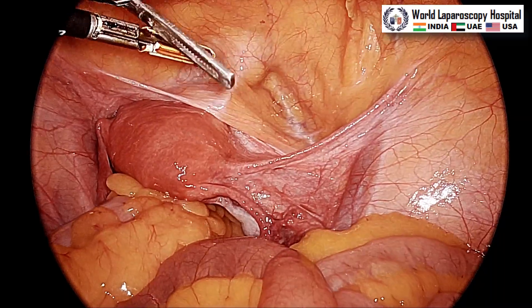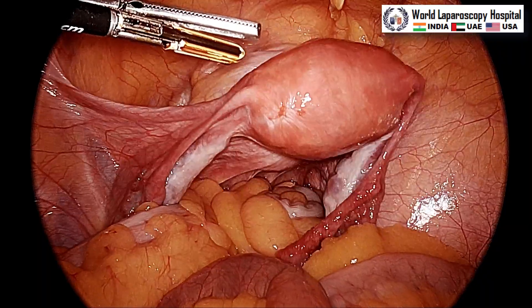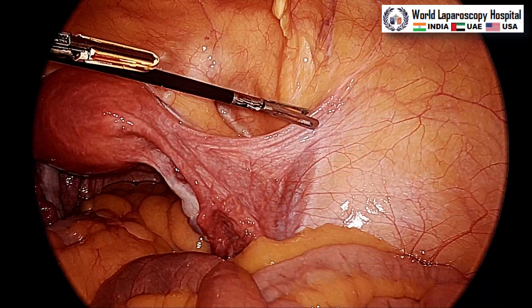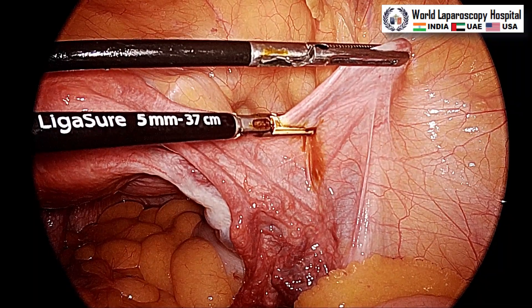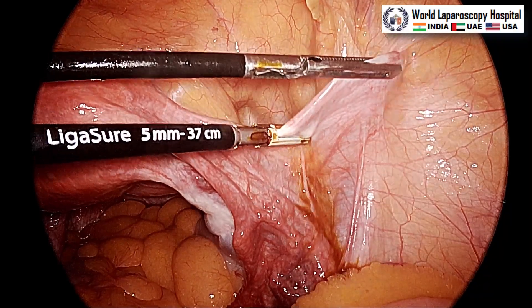Hello friends. This is a case of laparoscopic hysterectomy and we are performing surgery with the Stryker 1788 camera. This camera has a lot of advancements — it has an OLED screen with 4K resolution as well as many new features.